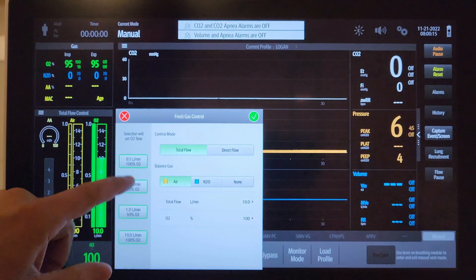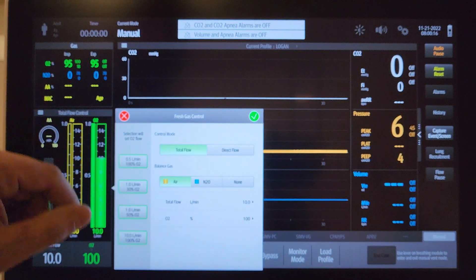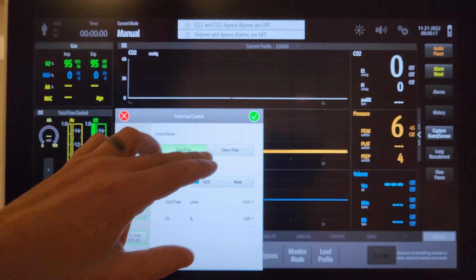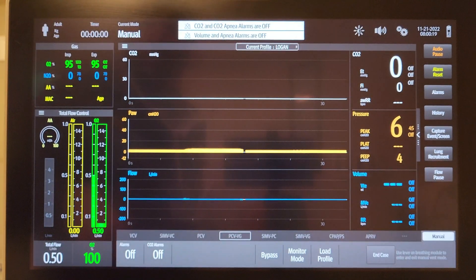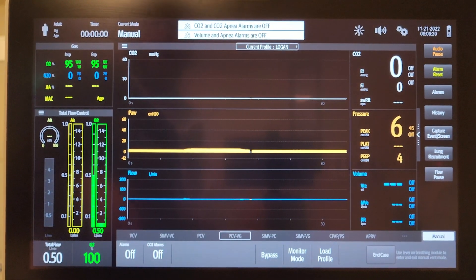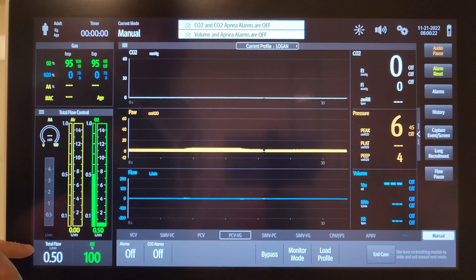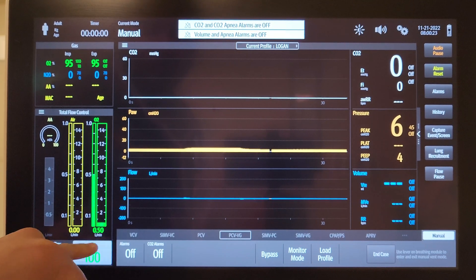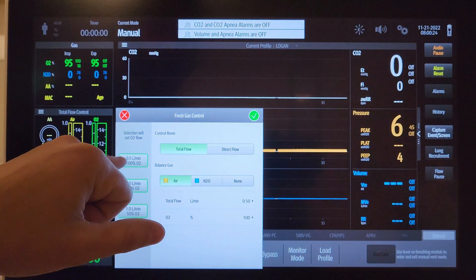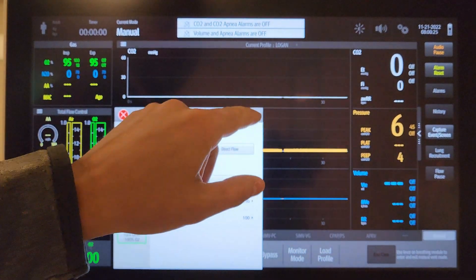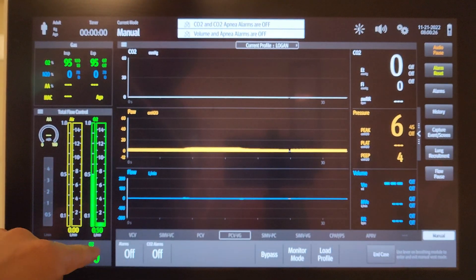I could also, if I just wanted to run the case, just hit 0.5 liters a minute and that will take my total flows down to 0.5 at 100% FiO2.